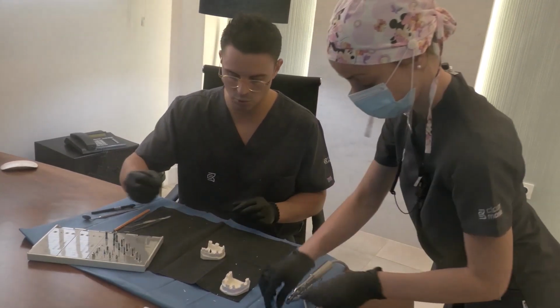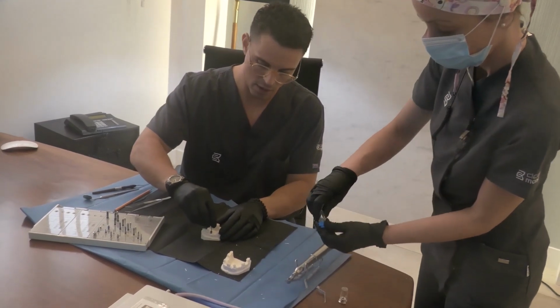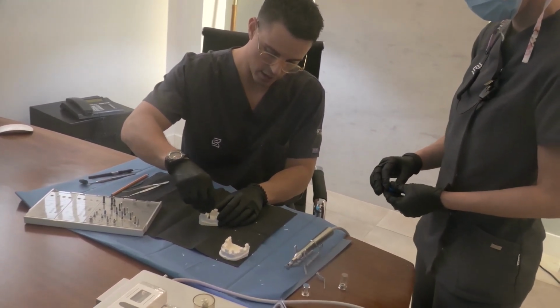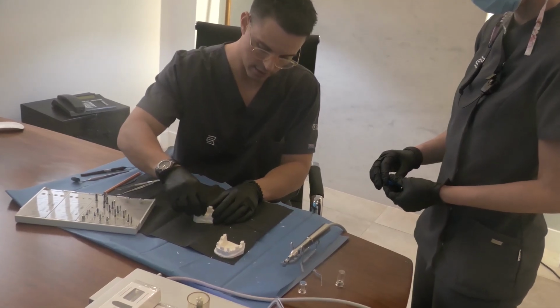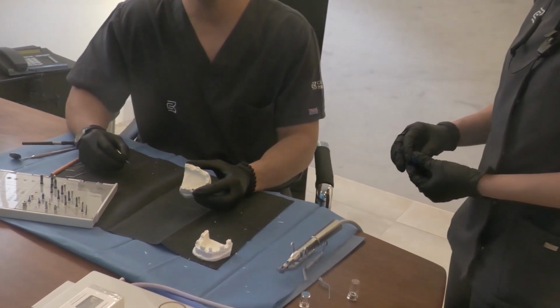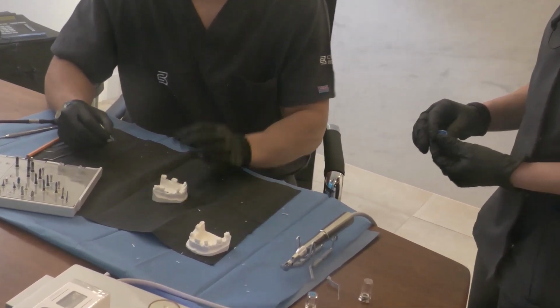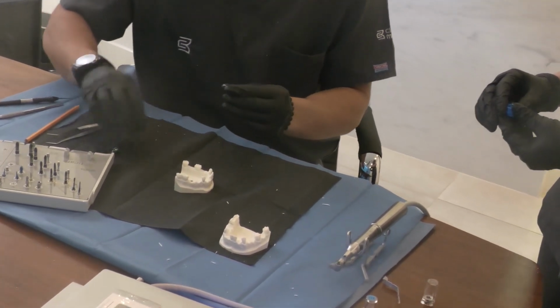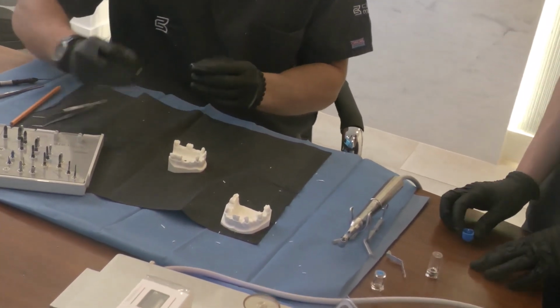So now we grab the screwdriver and we remove the top area of the implant in order to make sure that we have the implant placed in the ideal position. In case that you wish for any reason at this point to place it slightly more subcrestally, you can place it over again.